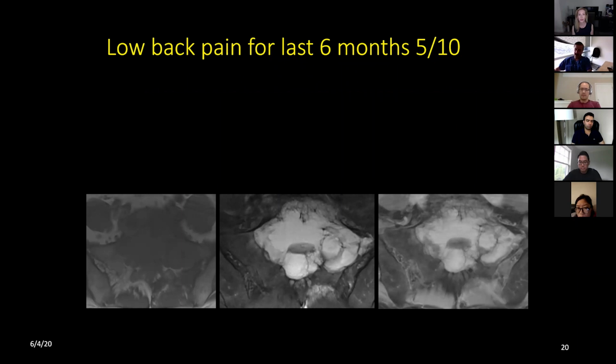And we're not doing it on every case. We're doing it when we are discussing this in our tumor board, and there is always a question of, hey, can this be this or this and this? So we're using this pre-biopsy, and right now we are still biopsying. But I think in the next 2 to 5 years, we would have gathered good data, and we would definitely be getting better, as we are in the brain world with brain tumors and all these parameters that we are using.